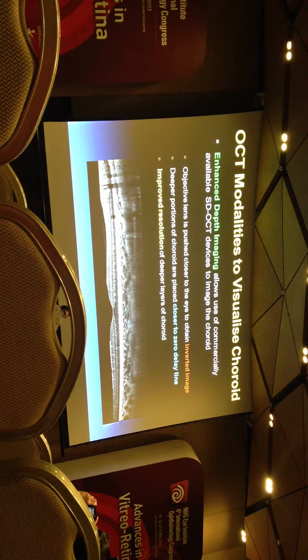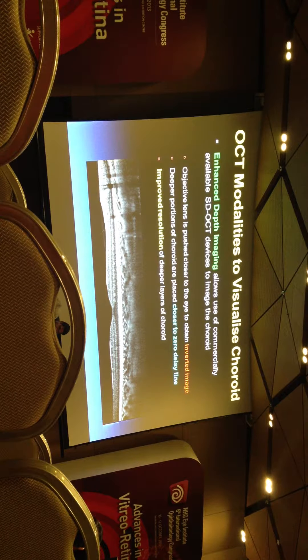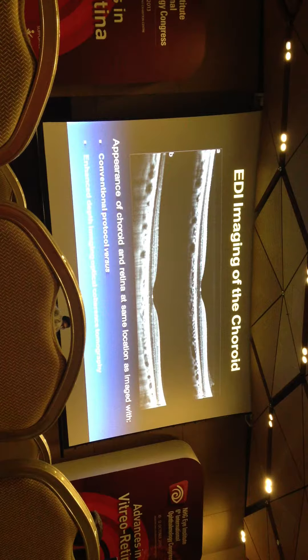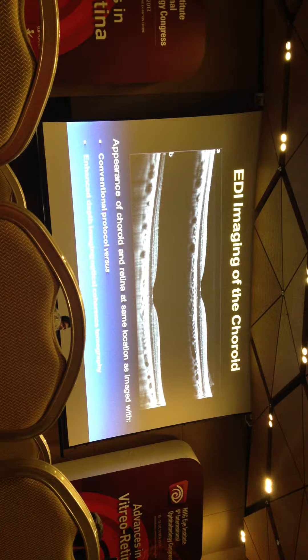In some OCT machines, like the Spectralis, when we push the objective lens very close to the eye, you actually see this inverted image. Now with the Spectralis software, there's a button you can press which will re-invert the image so that you see it as you normally would — but this is the raw image. This is an example of the same eye where, using a normal OCT scan, you see a bit of the choroid but not the choroid-scleral junction clearly. In the lower EDI scan, the choroid-scleral junction is especially clear.